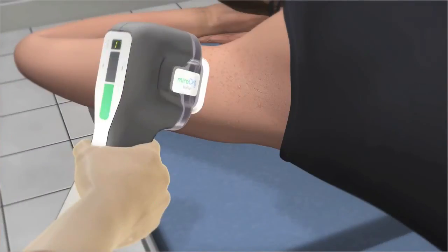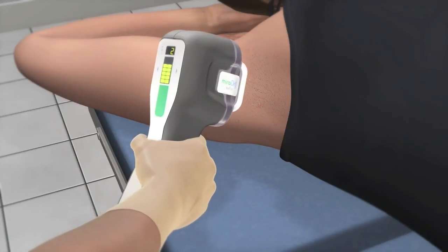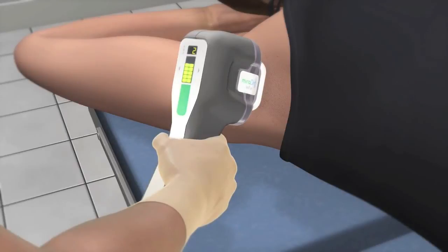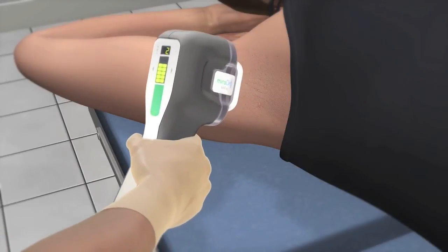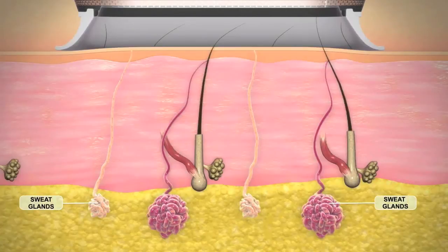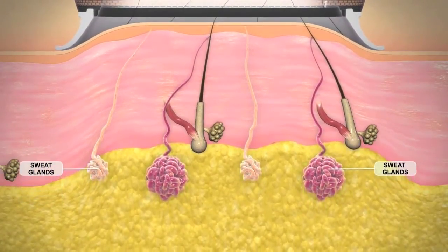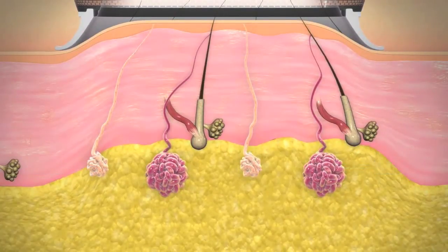No incisions or cuts are involved. The MiraDry system delivers electromagnetic energy to the underarm through the handpiece, which is applied in a repeating pattern on the underarm. This is done after the area has been numbed with local anesthesia. When the system is activated, vacuum suction from the handpiece stabilizes the skin and brings the sweat glands closer for treatment, protecting deeper tissue.